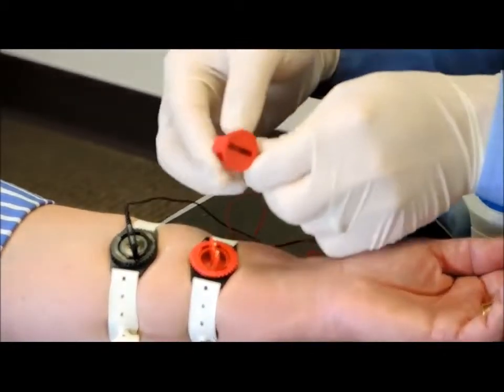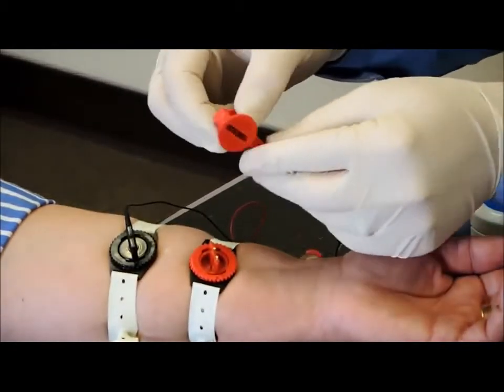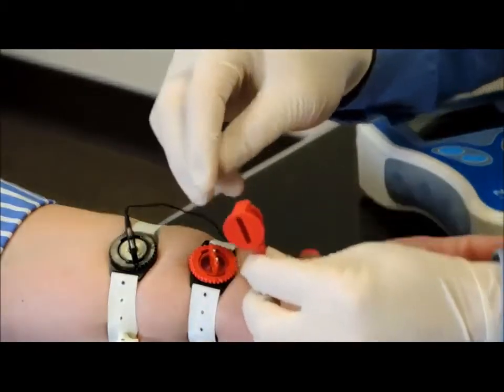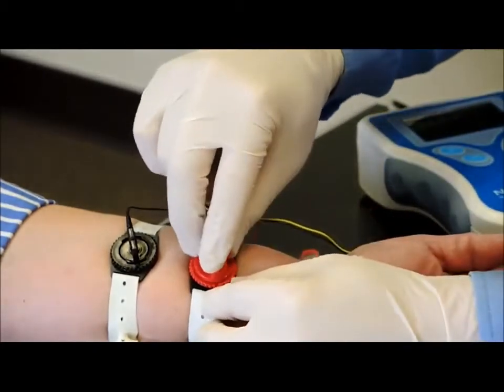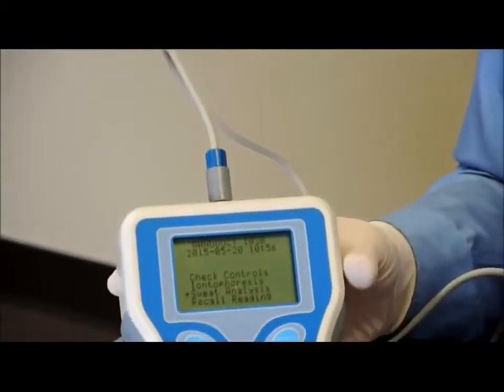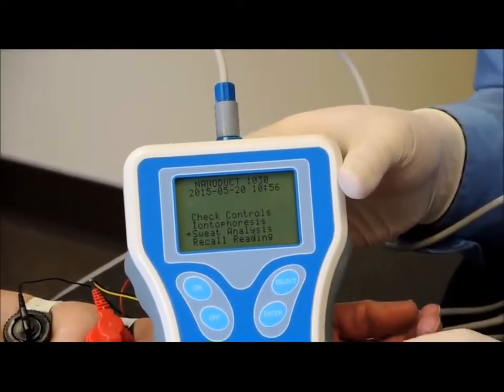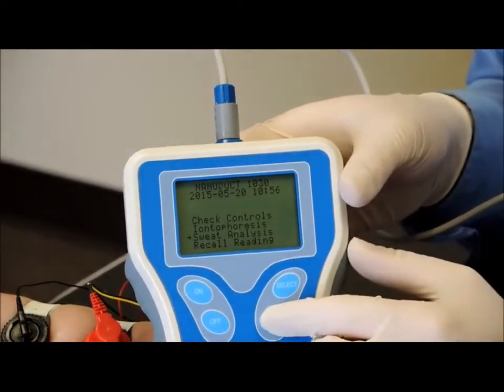Now this cable can be connected in two different ways. It can be connected this way or that way. If you look inside, there's actually 3 electrodes that it can plug into. So I plug in like that. Now on the screen, I previously said that it said sweat test. It does not. It says sweat analysis. It's the same process with the arrow pointed towards sweat analysis. I'll press enter.